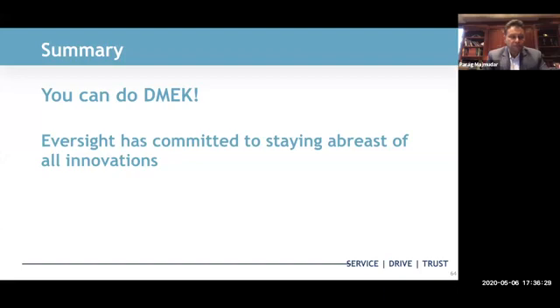Okay. Next question, also from Dr. Ahmed Omar. Can you please give more info on the rebubble cannula? Sure. I don't know the exact model, but I can find out for you. If any of you do LASIK, it's what I use for irrigating under the flap and putting the flap down. It's a 27 gauge curved cannula. It's not a round tip. It's almost got a little bevel on it. But you can use anything.